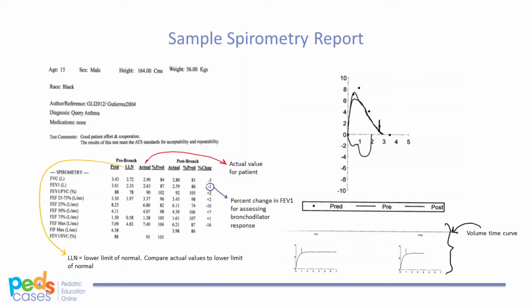Take a look at Figure 4. So just like every other test, it is important to make sure that it's the right patient. So take a look at the demographic details, including the name, age, height, and biological gender. I also look at the BMI, the body mass index, since obesity affects lung function parameters. Patients with obesity sometimes have a lower functional residual capacity, which is actually measured on lung volume testing, a different type of pulmonary function test.